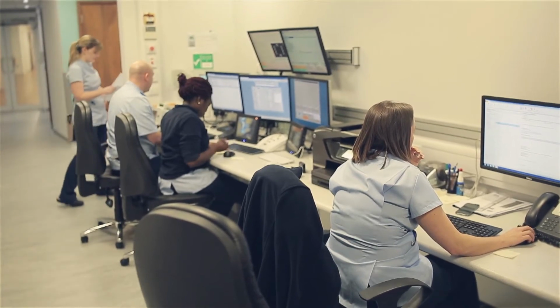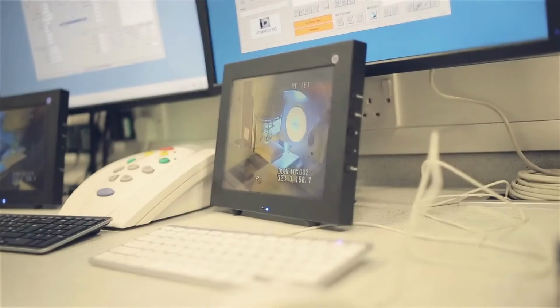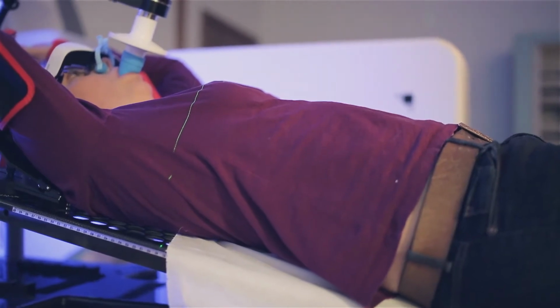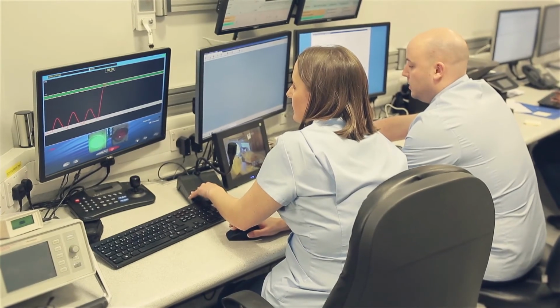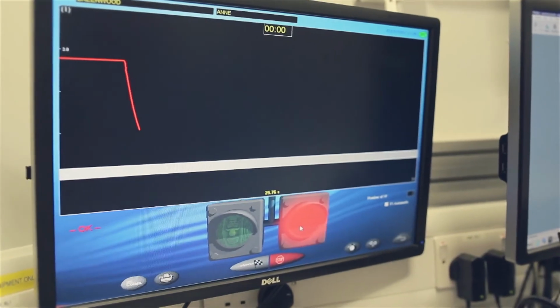The main patient concerns regarding the breath hold technique are more to do with what would happen if they can't manage the technique. Most of the patients are a little bit concerned about the claustrophobia of having something in their mouth, and also whether they'll be able to be in control of that breathing. Because it's a very simple system for them to use and they are in control, when they hold their breath, the treatment is turned on. When they breathe out, it's turned off. It's as simple as that.